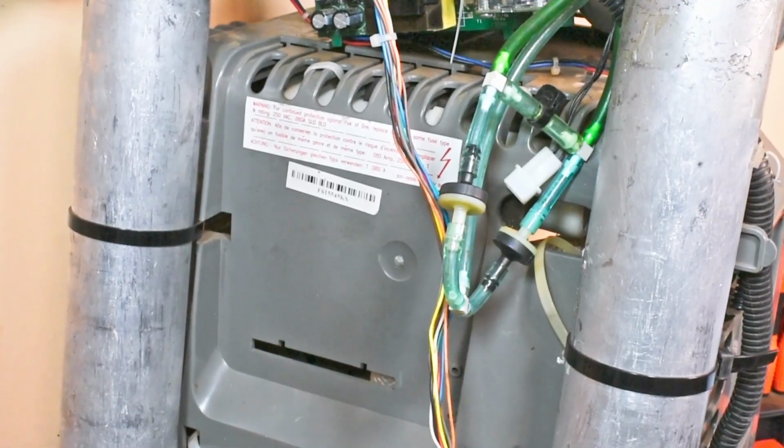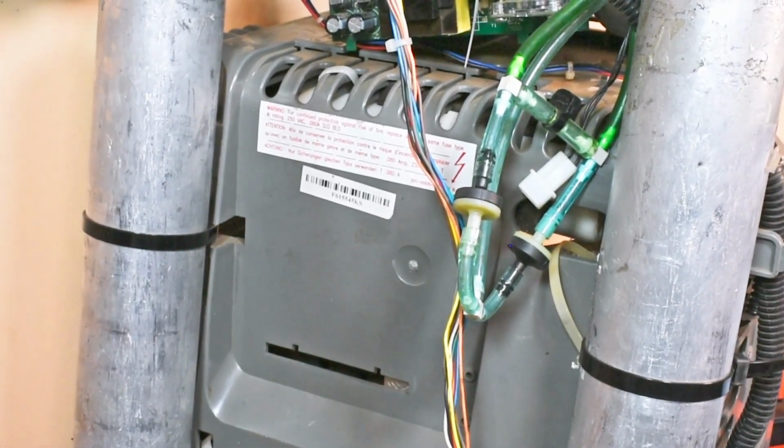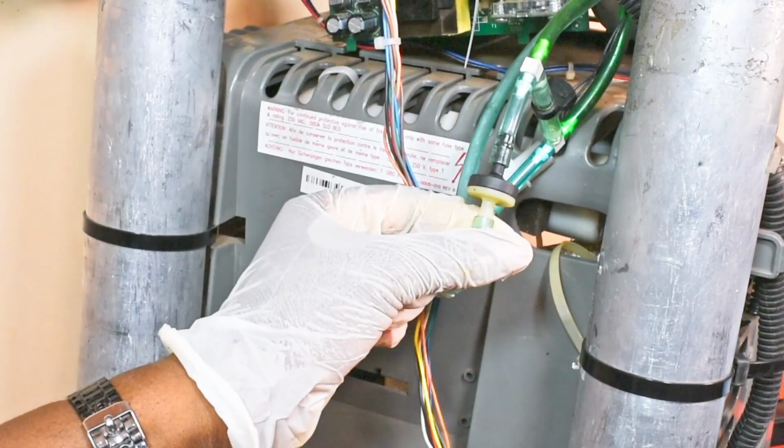I'll now restore the correct orientation of this check valve.